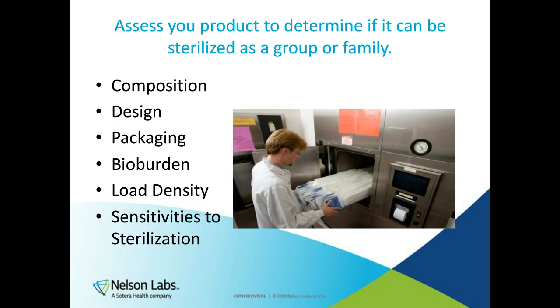Prior to performing any type of clinical batch release, it is a good idea to look into the composition and design of your product, as well as the packaging, the bioburden, and the eventual load density that you will be sterilizing either at a test facility or a contract sterilization facility. And you must understand or at least identify any type of sensitivities that your product may have.